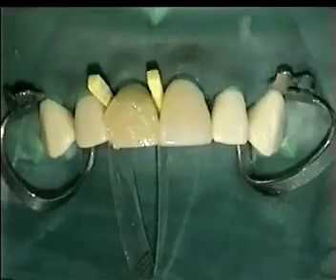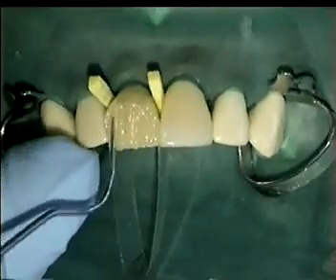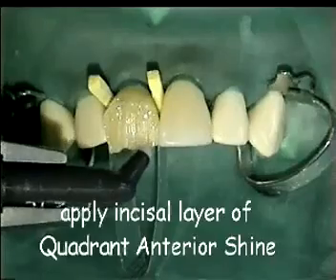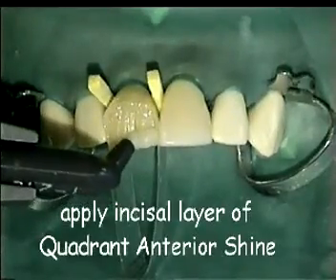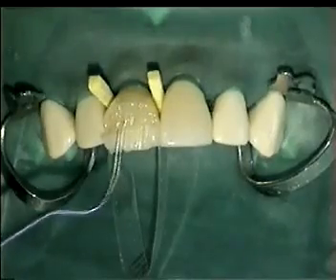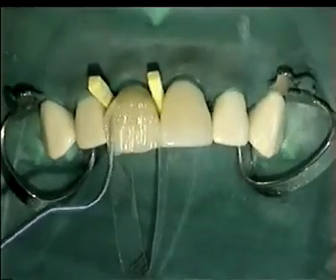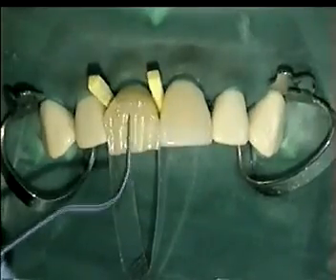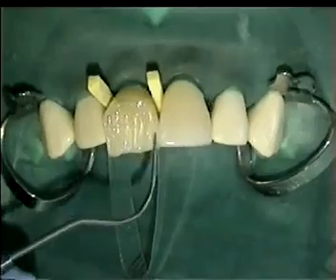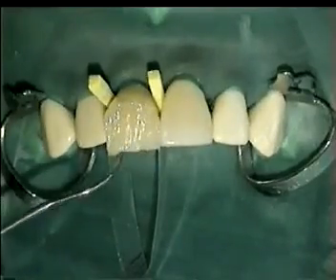In this way a natural appearance is accomplished. This is contrary to the more stiff composites where the last layer will be pushed away. Finally a layer of incisal composite is applied. This has more transparency, just like the incisal enamel.